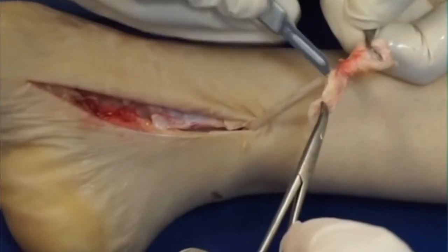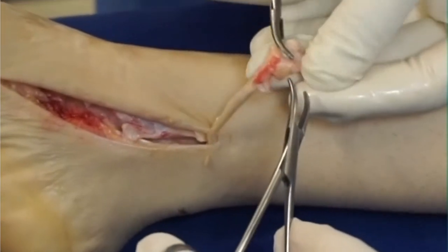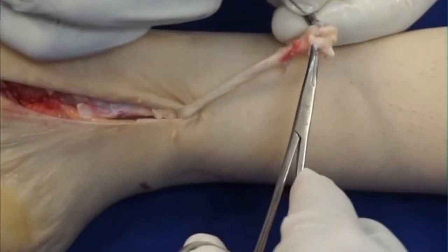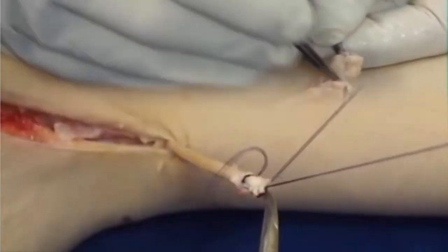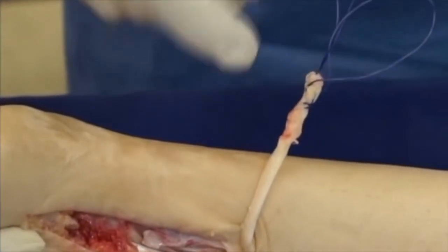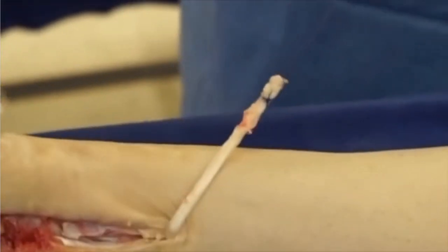I want to remove all the soft tissue from the tendon and maintain a thin stump so that it passes easily through my drill hole on the lateral side of the foot. In order to do so, I'm going to split the tendon in half at the proximal stump so that I've got a nice narrow tendon to pass into the foot. Once I've cut it, I'll start my suture on the tendon. In order to prevent the tendon from bunching up, you need to create a small noose around your suture so that it grabs the tendon — pulling that little circular noose of suture around the tendon makes the tendon go quite flat or tight at the tip so it won't bunch up as you pass it from the leg into the foot.